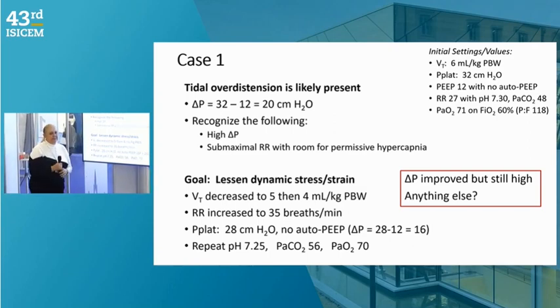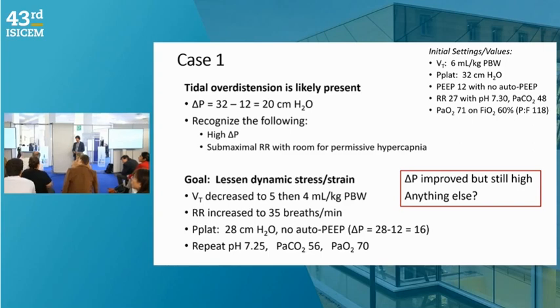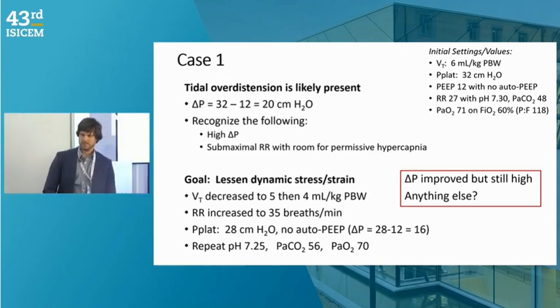Sorry, what I wanted to add is that looking at these lines now, the PaO2 didn't change. Of course, we did quite a lot in trying to ventilate with lower tidal volume, higher rate. The PaO2 did not change. It fell actually from 71 to 70. So this is no progress.